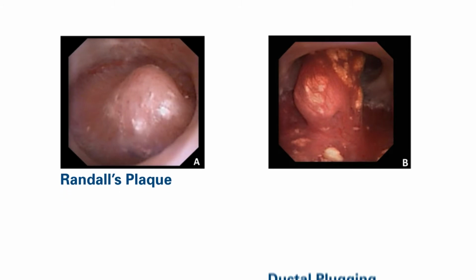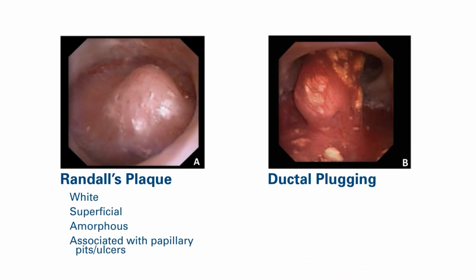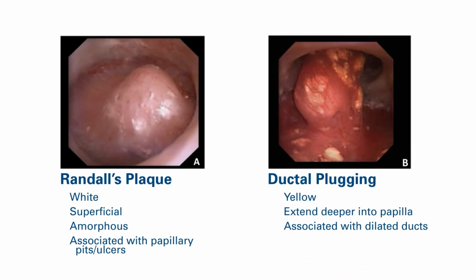Some people have pretty profound papillary disease, a lot of plaque, flattening of the papilla, a lot of ductal plugging. And my suspicion is that this correlates with stone activity. And it's very possible, if not likely, that this can be an indicator of an underlying metabolic disturbance, a higher risk of recurrence or disease progression, and possibly other features as well, like coexisting renal dysfunction or kidney insufficiency.